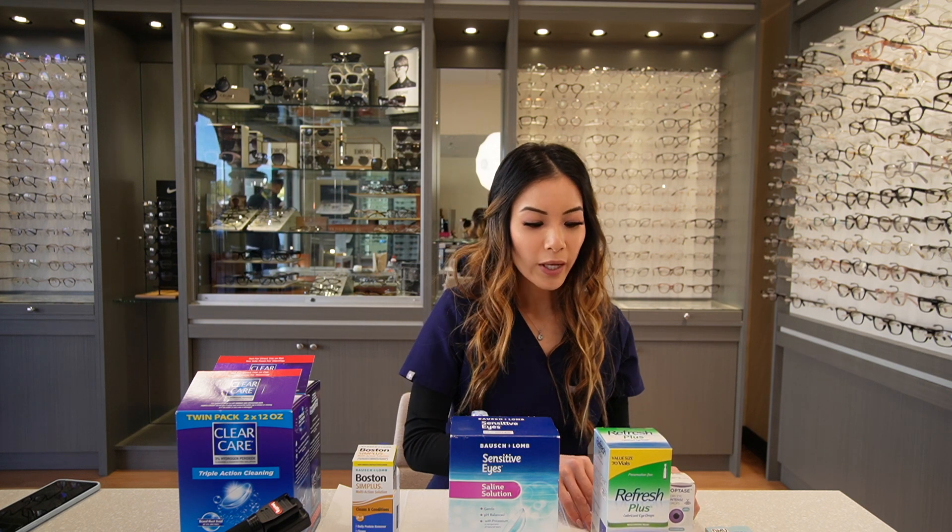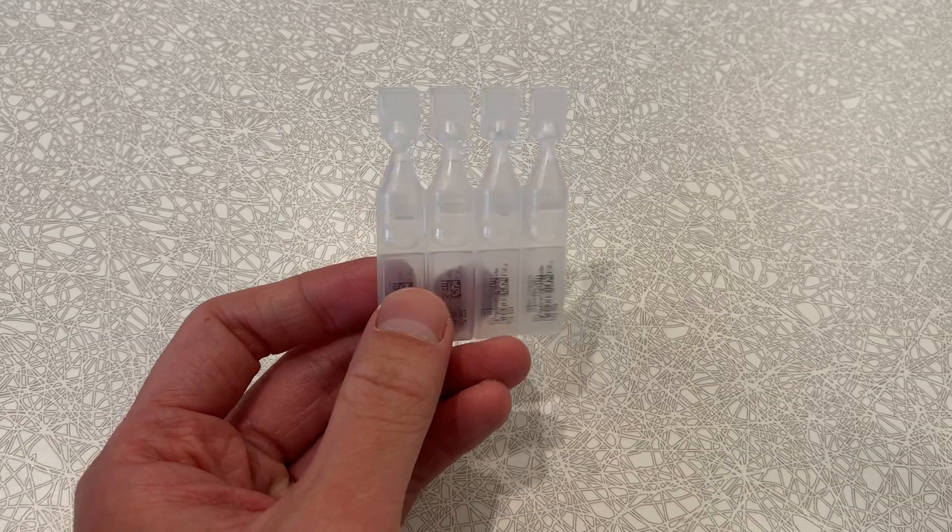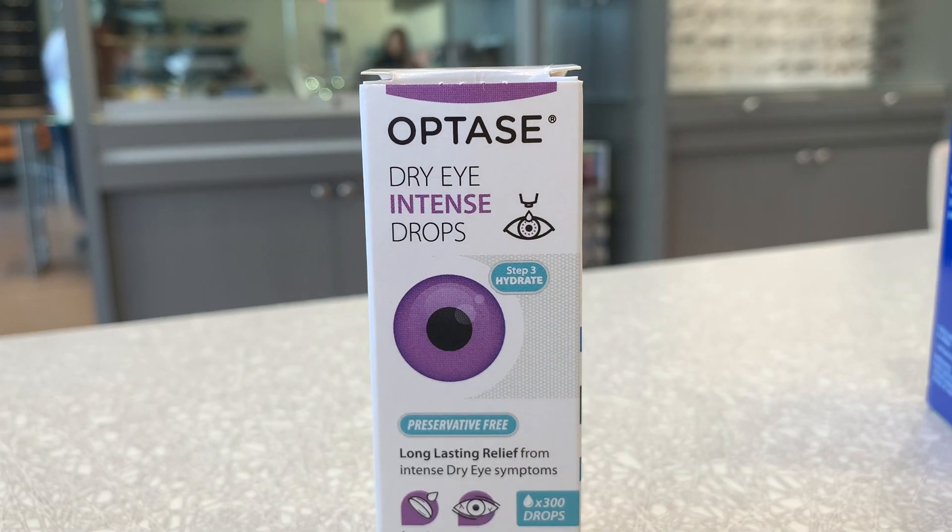Our fourth product is Artificial Tears. The key is that it has to be preservative free. Here we have two different brands: Refresh Plus, which are single-use vials, and Optase, which is used by the bottle.